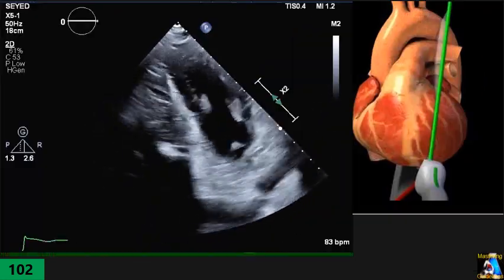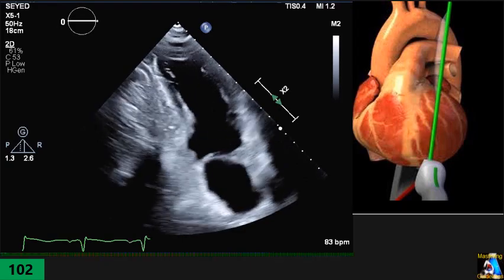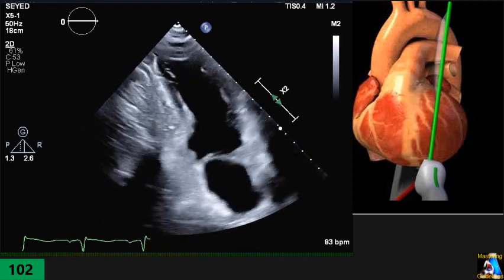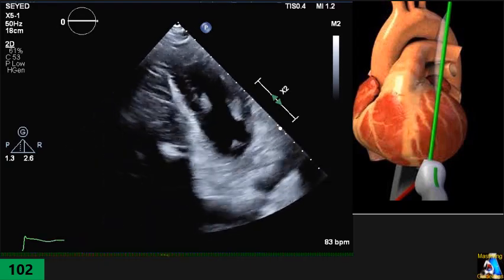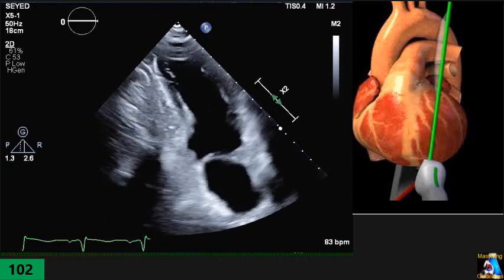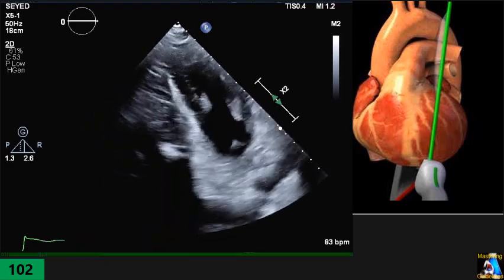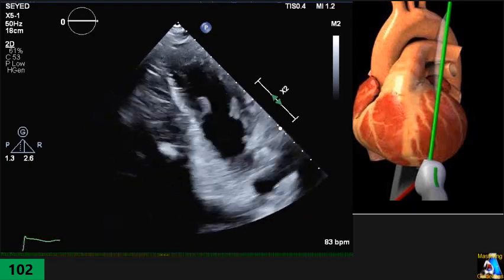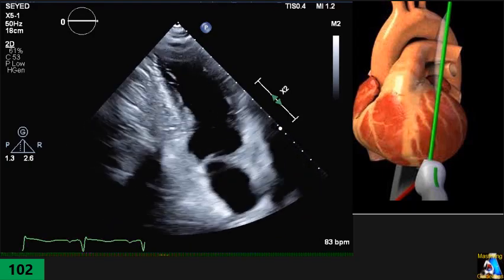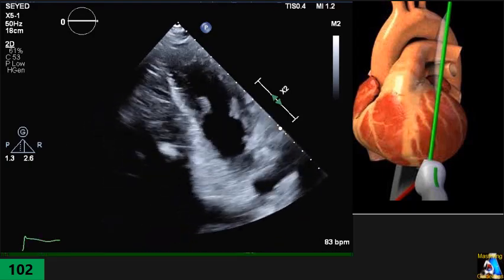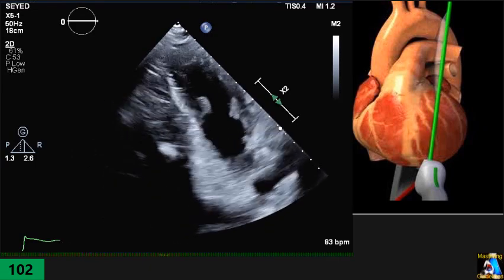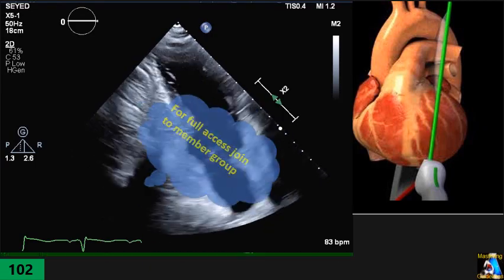I'll also cover what to do on the stress echo — the tricks that can help you a lot to get apical 2 and 3, especially in patients during stress echo.